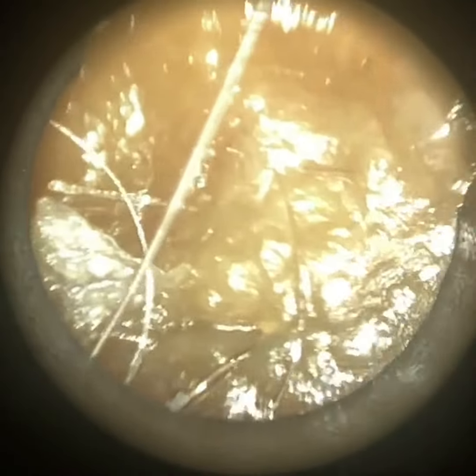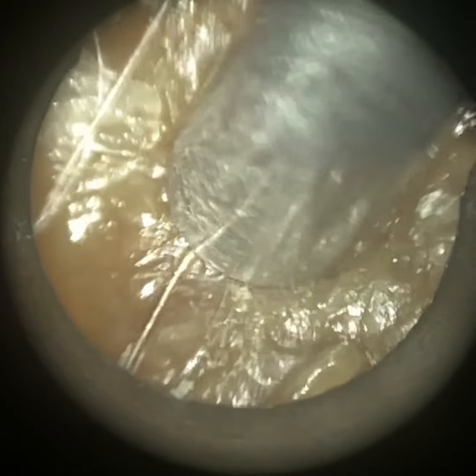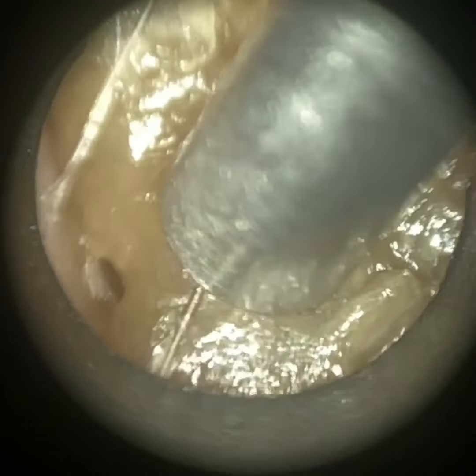Hi everyone, this is Neel Raithatha, consultant audiologist and director of Clearwax. Thank you for joining me in my latest video using the WAXscope. Here we have a patient who attended with bilateral fully occluding earwax plugs.